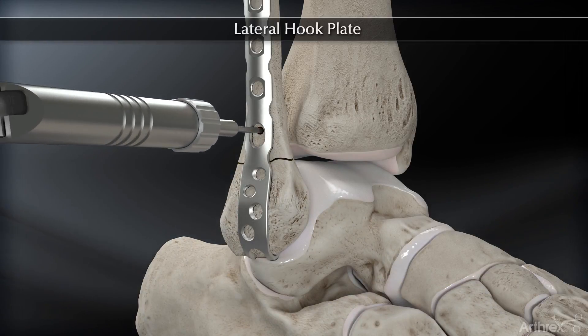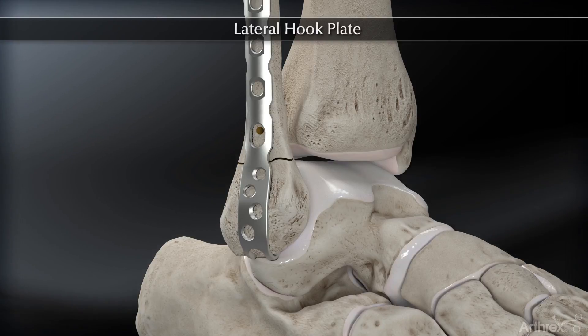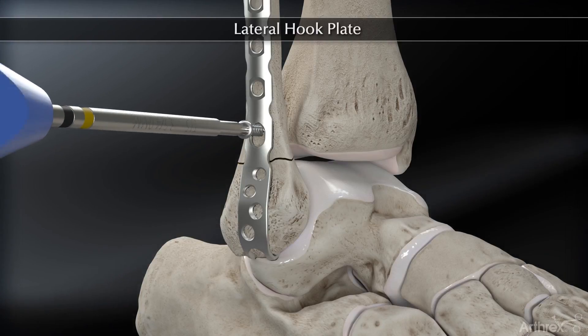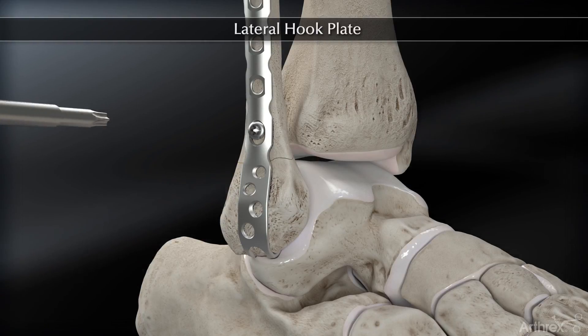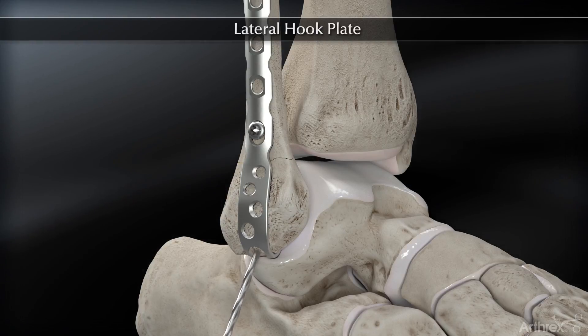The first screw placed is either a 3.5 cortical non-locking screw or a 4.0 cancellous screw into the oblong hole, placed superiorly to allow for some compression both at this stage and then after the distal screw placement.